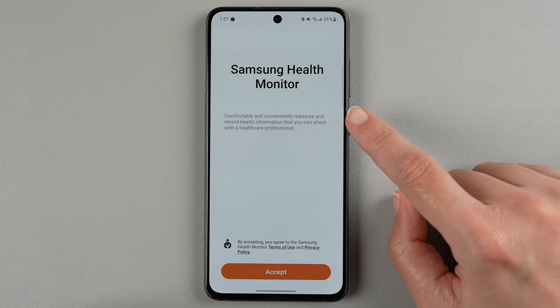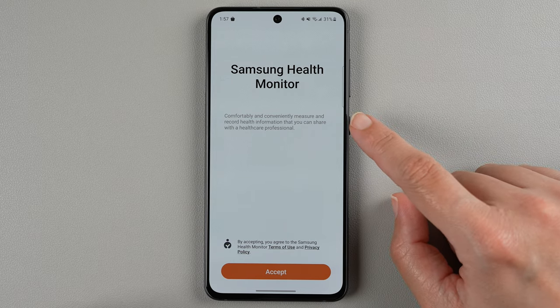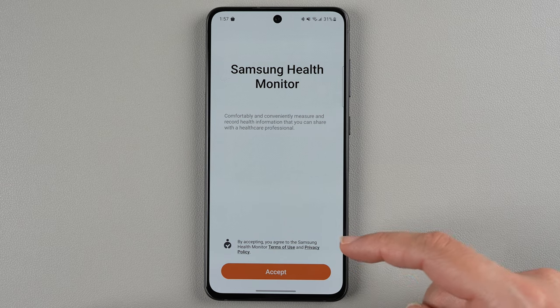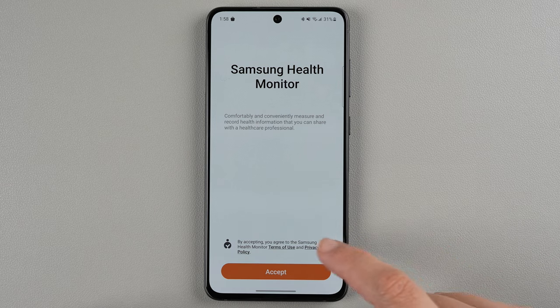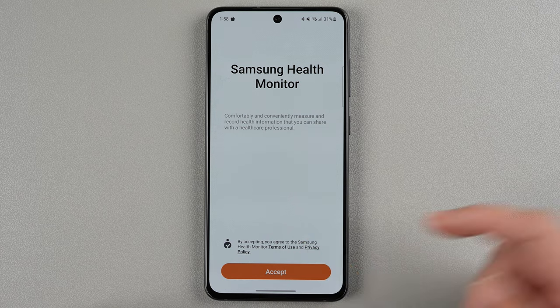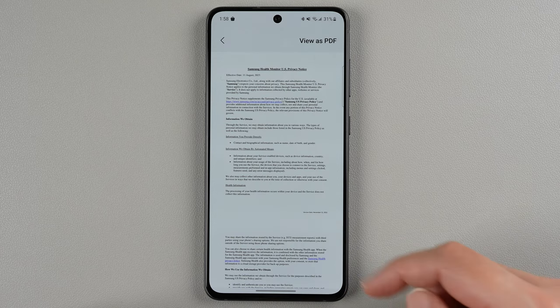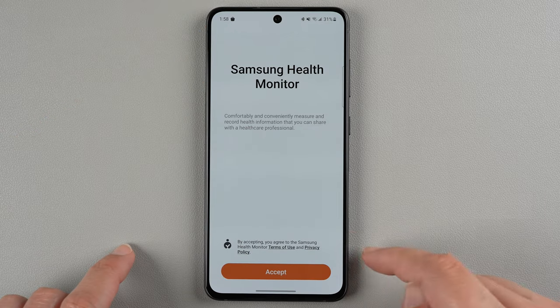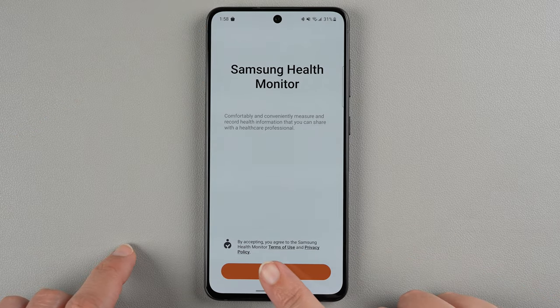It says comfortably and conveniently measure and record health information that you can share with a healthcare professional. I'm going to go ahead and tap accept. You can also tap terms of use or privacy policy if you want to read the privacy policy and terms of use that you are agreeing to. If you're okay with all that, go ahead and tap accept.